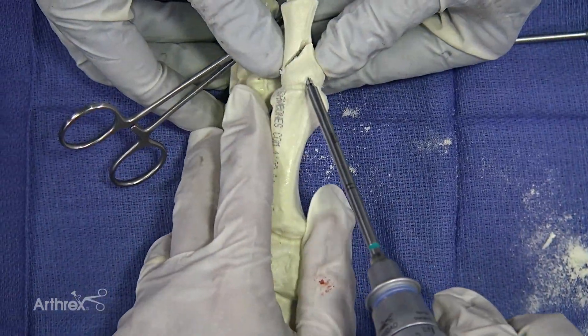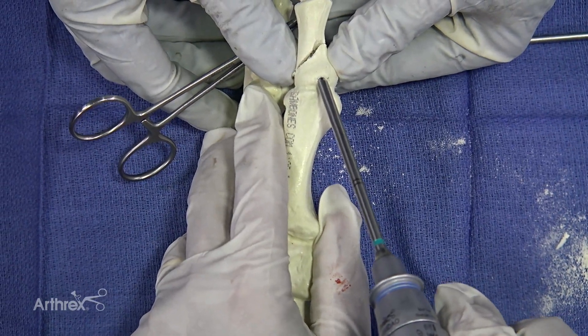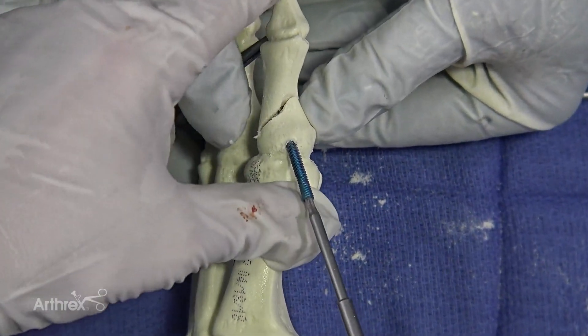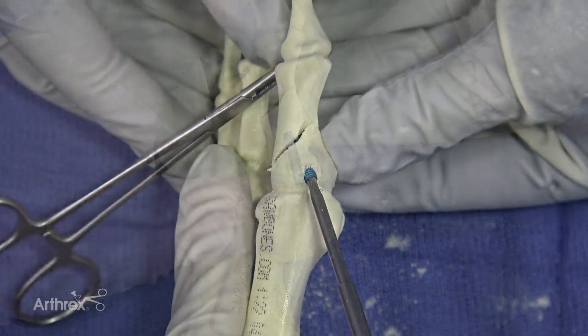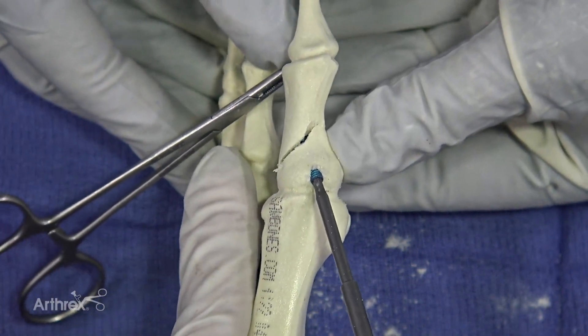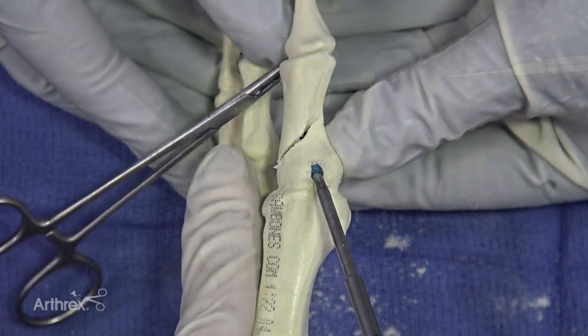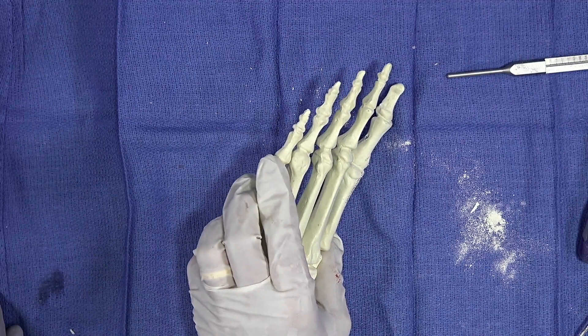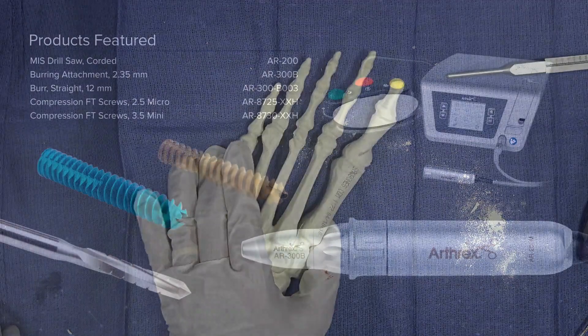You use the profile drill and then while you're putting it in you could hold your reduction. You can see how that compresses down nicely — it's nicely compressed our osteotomy and it's through the far cortex.